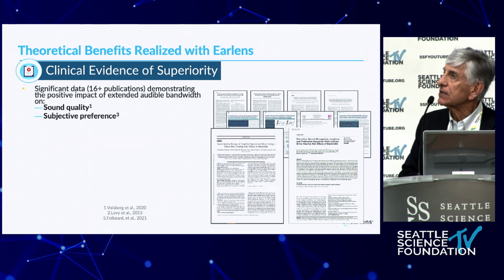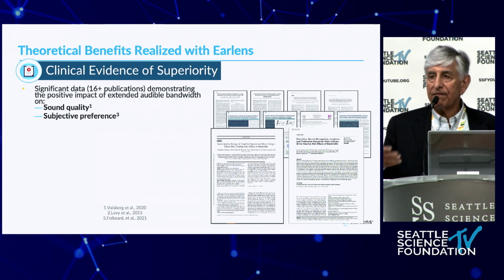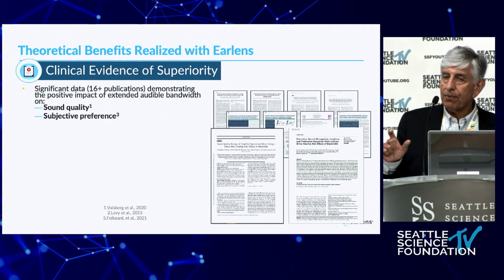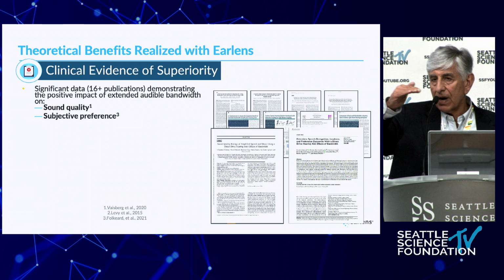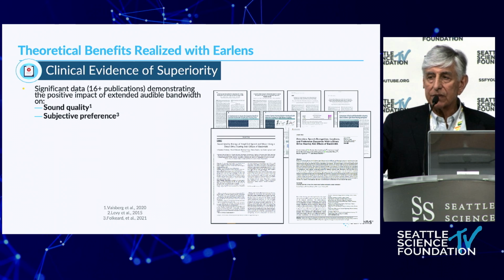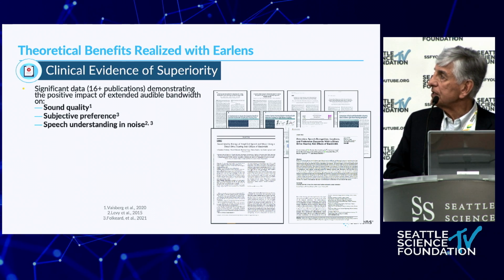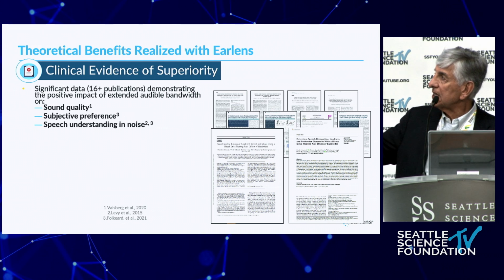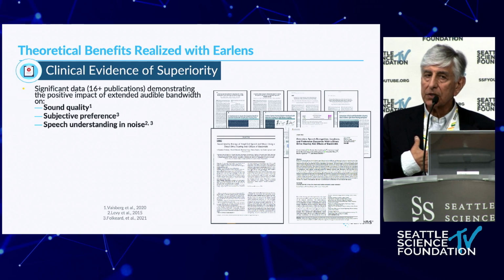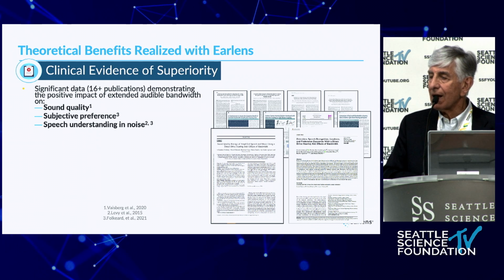And you talk to patients because your practice is no different than my practice. I see a lot of hearing loss, but it's hard to convince somebody that this is worth more than a traditional hearing aid. There are pre-programmed hearing aids for a high-frequency hearing loss, and you can sell those to patients for about $12,000 for two. So I have to go through this whole hearing discussion also. And because this is so expensive, we do have to select out a few patients. But these are the three most significant changes that I can offer patients with an Earlens. And I personally never go to an Earlens first. I make them wear a traditional hearing aid for at least a month, and then we decide how to go into this other hearing technology.